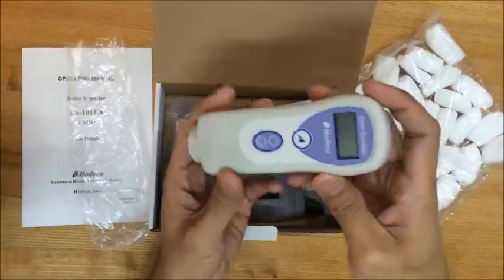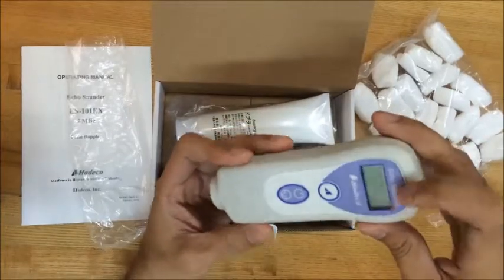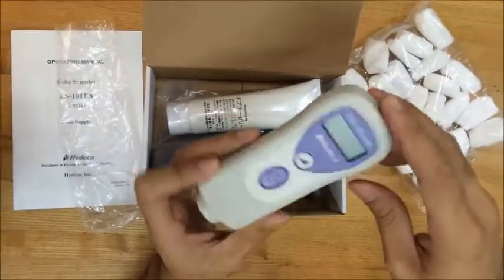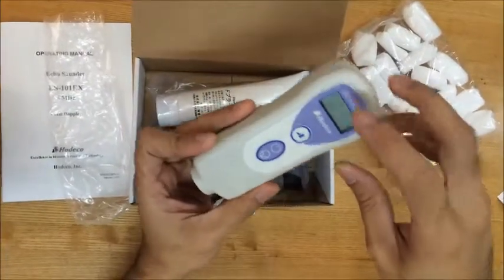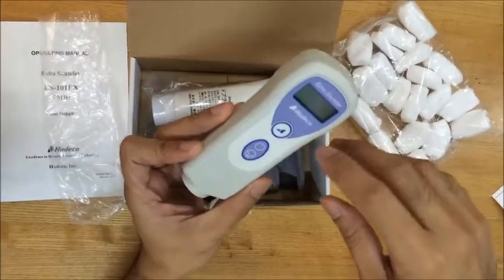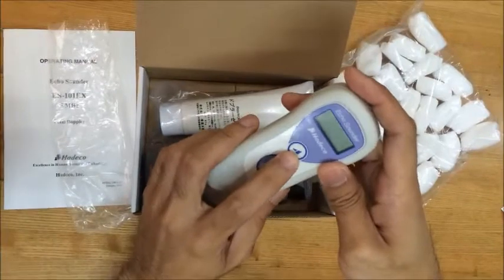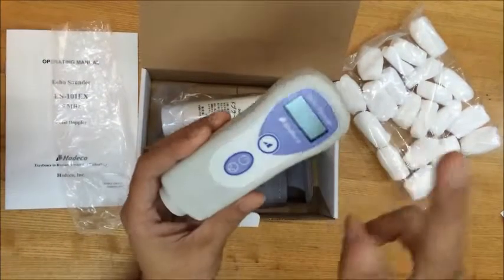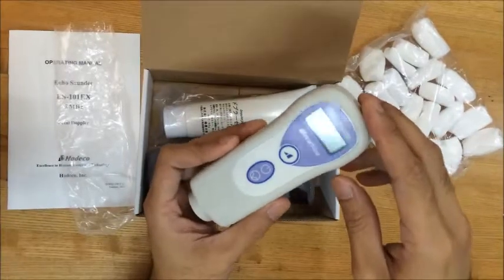The Hadeco Ecosounder has this LCD on the front. This is to display the heart rate and other indicators such as low battery and the volume. Here is the volume button. This is to adjust the volume in two steps or to adjust the function mode.